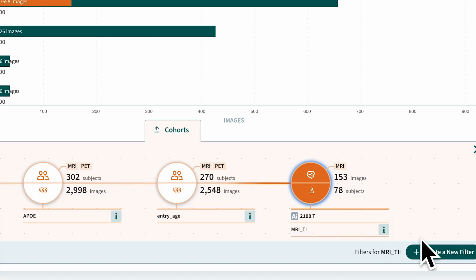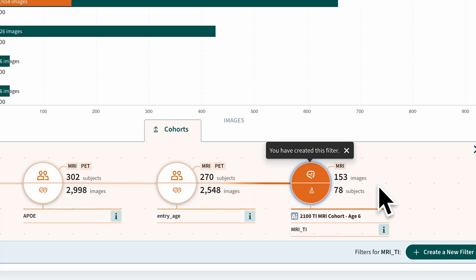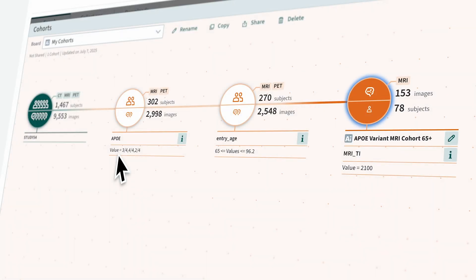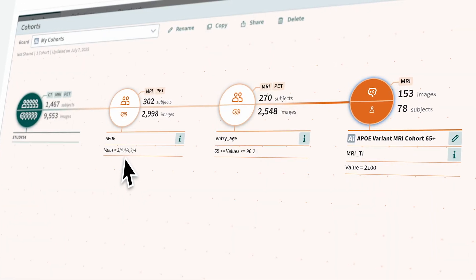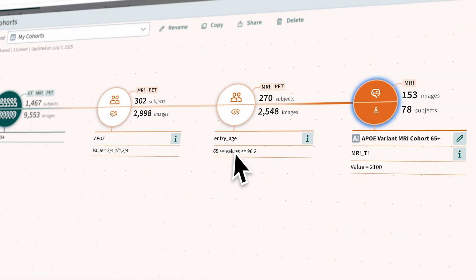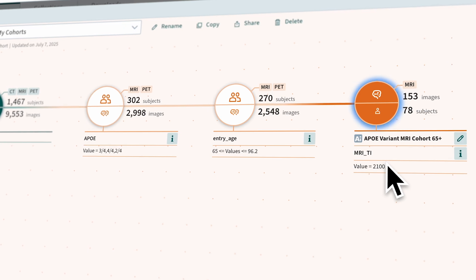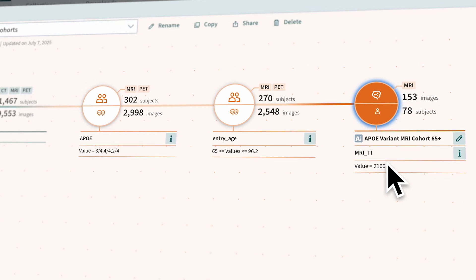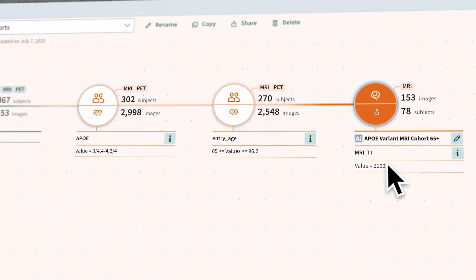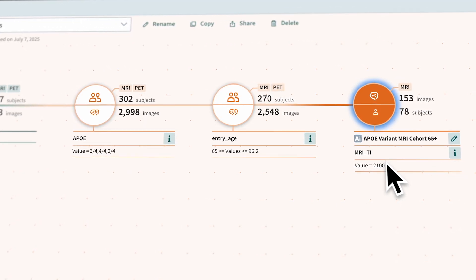A new filter has been added and we have created a cohort of APOE for subjects who are 65 years old or older and have MRI scans with an inversion time equal to 2100 milliseconds.